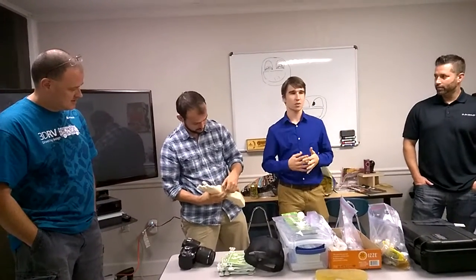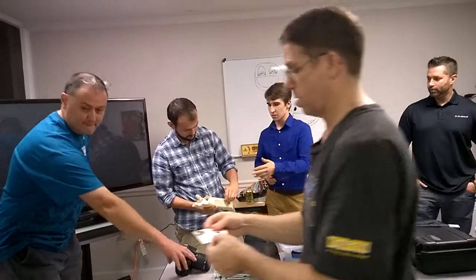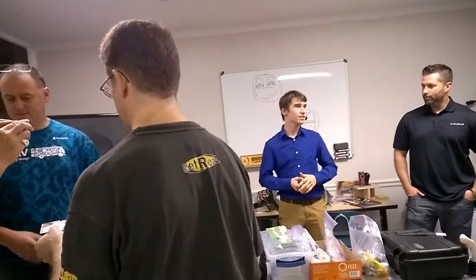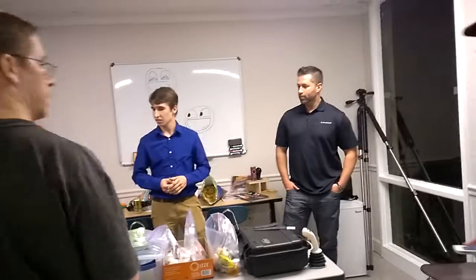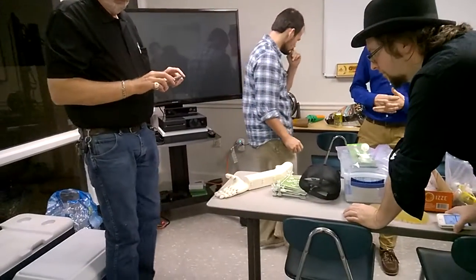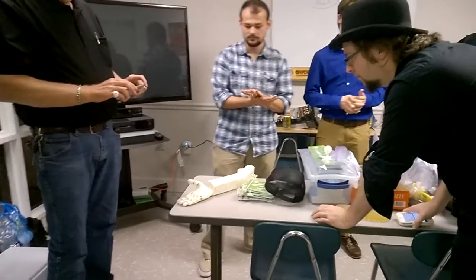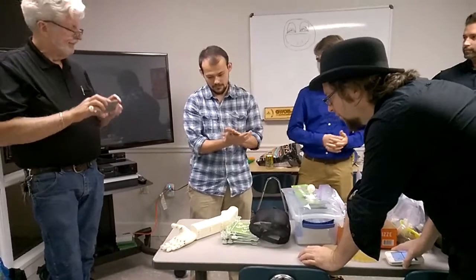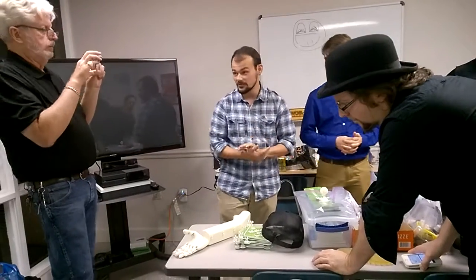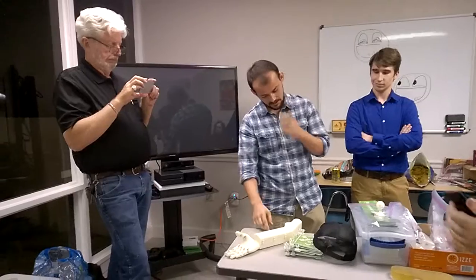I don't know if you saw the news story — probably about two months ago — where we created a 3D printed arm for a little boy named Alex in the Broadland area. It's completely electronic, and we printed it off of a Stratasys Dimension printer. He knows all about that — I work in the manufacturing lab at UCF, and we did a lot of the 3D printing.